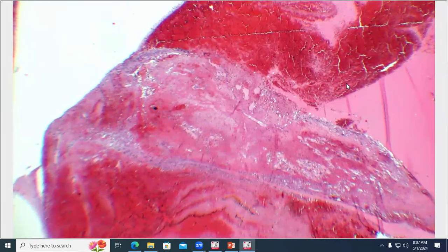And if you see this type of pattern inside the eye with a lot of hemorrhage and retinal detachment, I would strongly suggest in most of these cases that you go look at the blood vessels in the eye, particularly in a dog looking at the central choroidal vessels and the vessels around the optic nerve and the retinal vessels themselves, which are common places for vascular remodeling associated with hypertension to appear. However, in this case, this is not a hypertension case, just a plug to make sure you look at your vessels if you see this pattern.